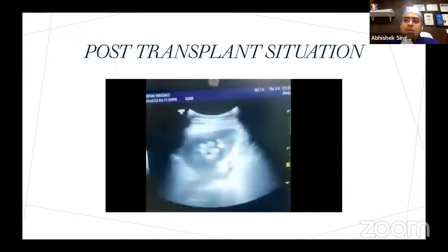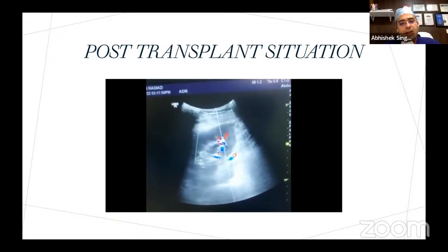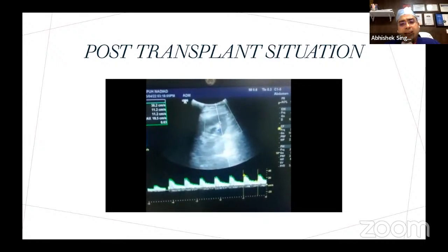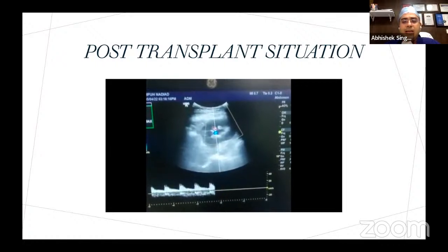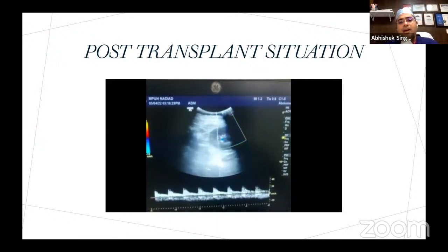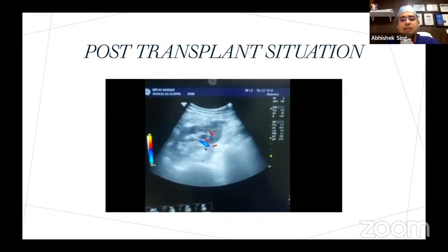When we are talking about anomalous positioning of kidney, post-transplant situations are also situations where kidneys are placed in an anomalous location. So what is the implication of ultrasound to a surgeon? One is, is the kidney lighting up well? Is it well vascularized on all poles? If yes, then what is the resistive index? If the resistive index is high and the vascularity is good, it could be a situation where you are dealing with a rejection. Or even in situations where tacrolimus levels are high and the creatinine is getting high, by doing a simple Doppler and by establishing a raised RI, you can say that the surgical part of the procedure has gone well.